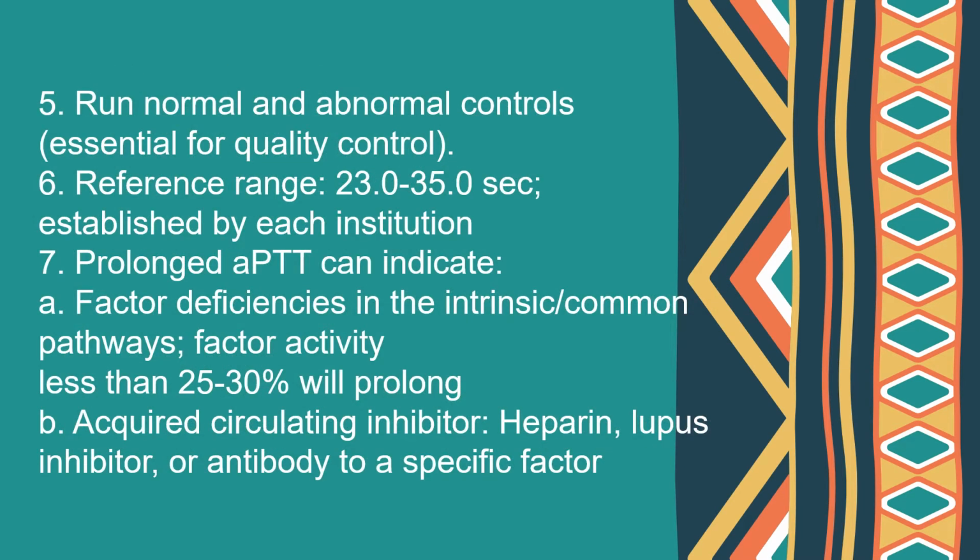Normal and abnormal controls are run together with the patient samples, so for quality control, and the reference range would be around 23 to 35 seconds, but this may also depend on the institution.